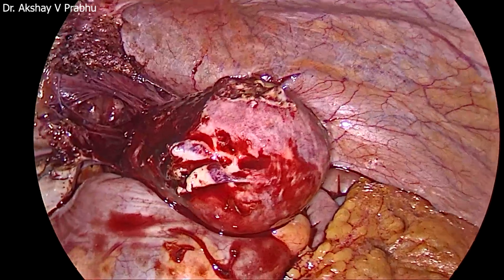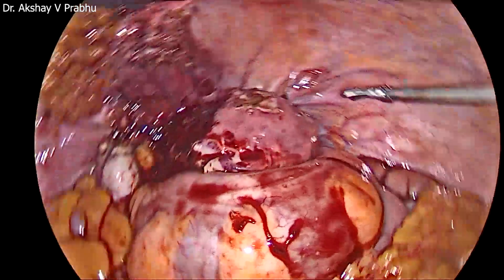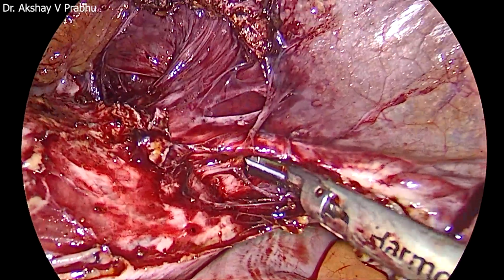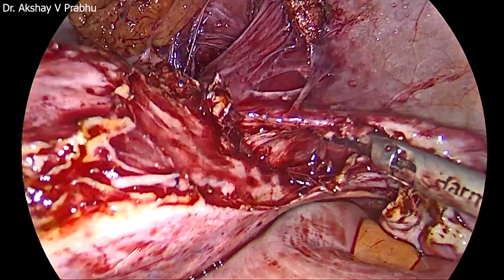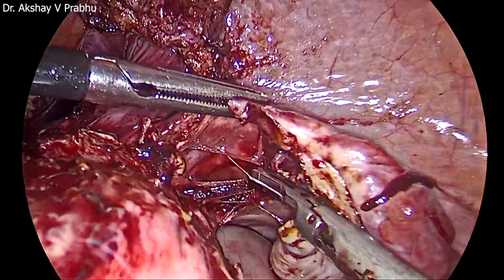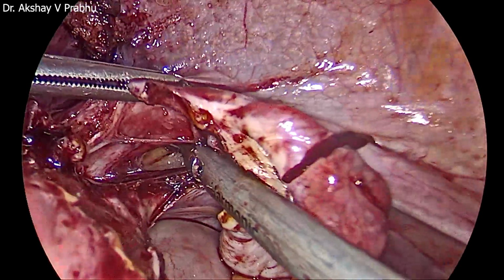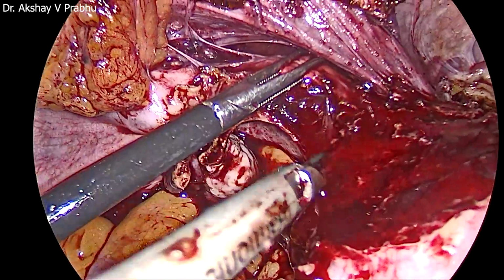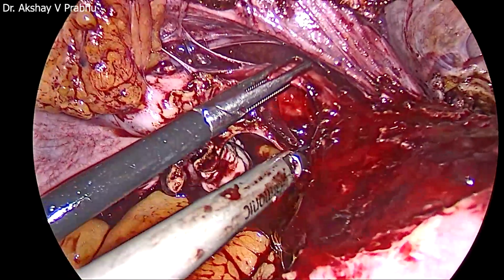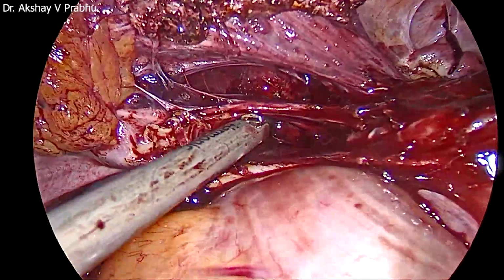I'm also taking help from above just to ensure that the uterus is on stretch. On the left side I encountered some bleeding. I didn't want to go poking in the same plane, so I've come to the right side to see what I can see. From the right side now I've got a very good plane. That is what is called the virgin plane, and you can see areolar tissue. These are basically venous plexuses which are bleeding.